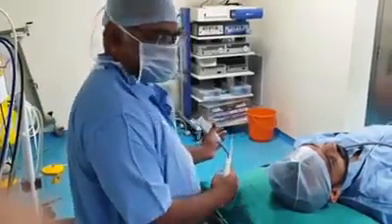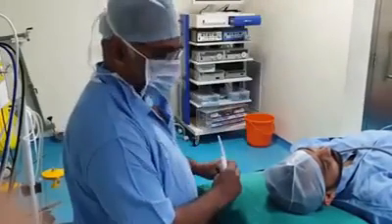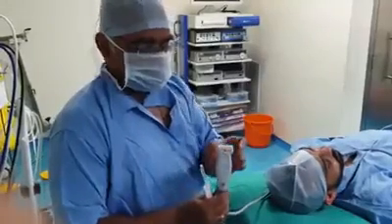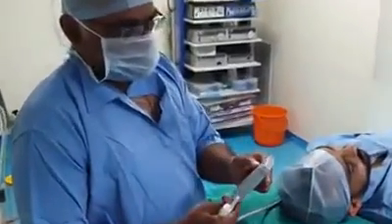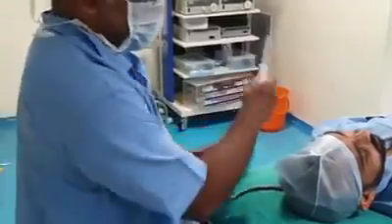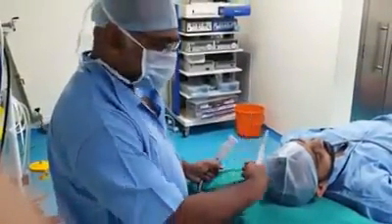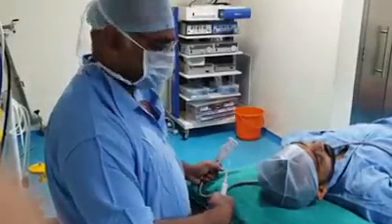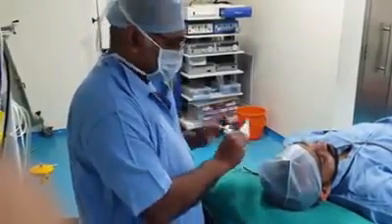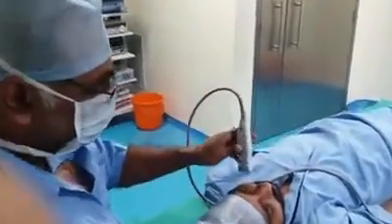Now I am going to demonstrate how the sphenopalatine ganglion injection is done on the left side of the patient. The probe which is used is a high frequency linear probe with a shorter footprint. It is the L25, you can see that. When I am going to do it on the left side, it is always preferable that I stand at the head end of the patient, because the needle is going to come from the medial side. Now, this is the marker that is going to come on the medial side.